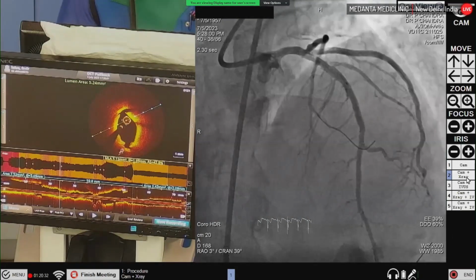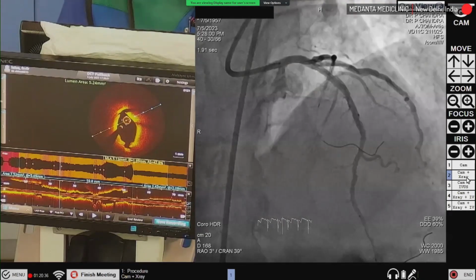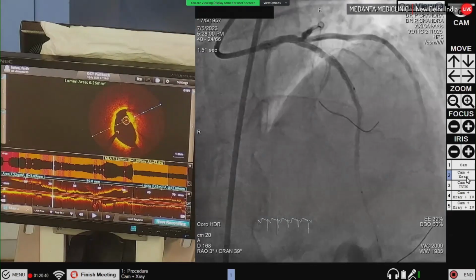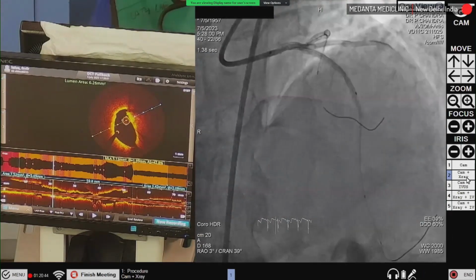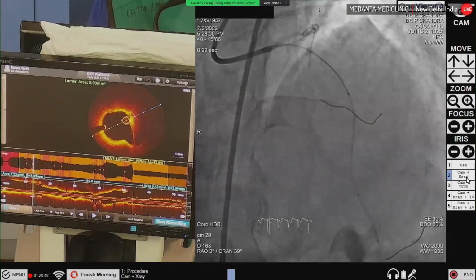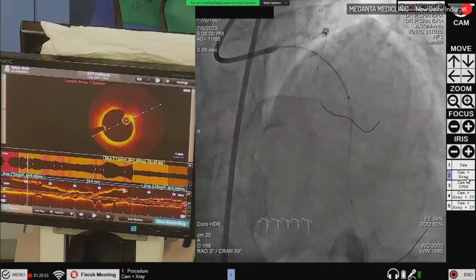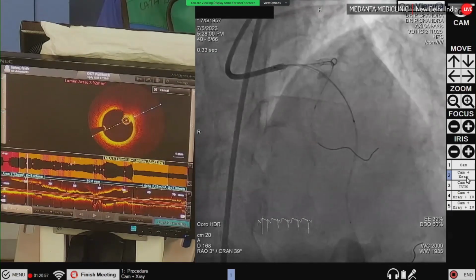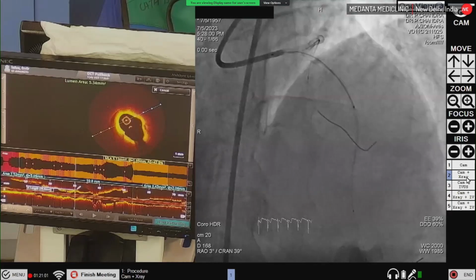We take a stent, 3 millimeter stent, please, or a 3.5. Give me a 3.5. Go distal. 20. Maybe you can take a 28 or something. 3.5, 28, 20, 24, 28. Take 24. Give Onyx. 26. 3.5, 26 Onyx.